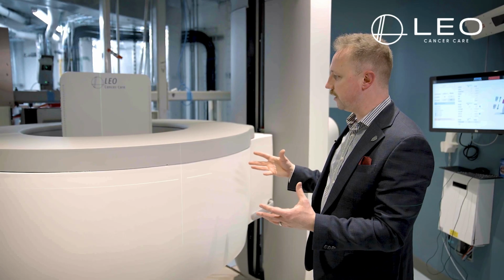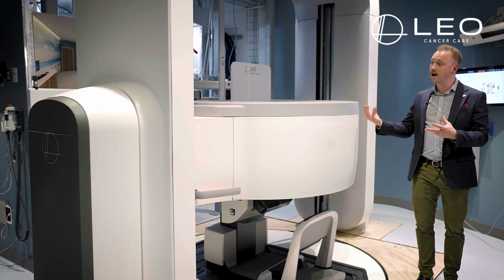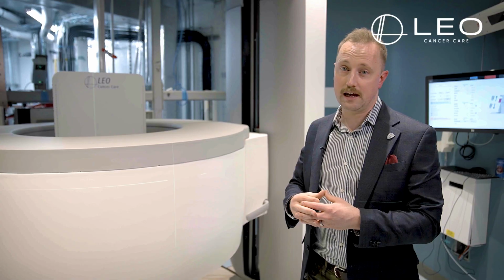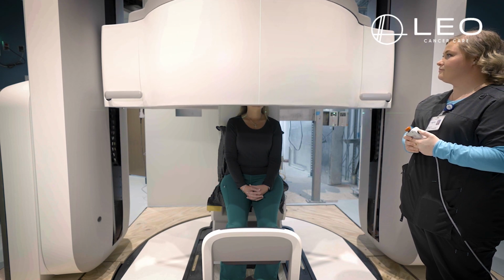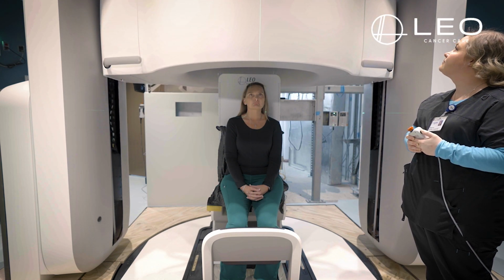So the imaging ring comes down around the patient based on their indication and is acquiring an image as this goes back up. And this is not a cone beam CT. We're really pushing the boundaries in terms of the image quality at isocenter. This puts all of the power back in the hands of the radiation therapist to truly see the internal anatomy and truly see the tumor volume that we're treating.